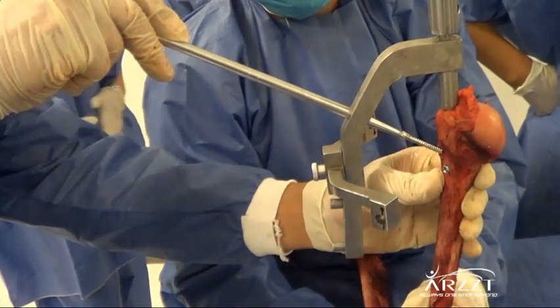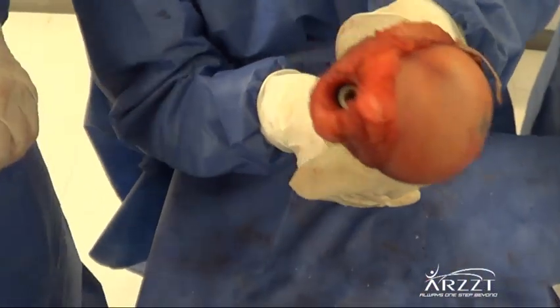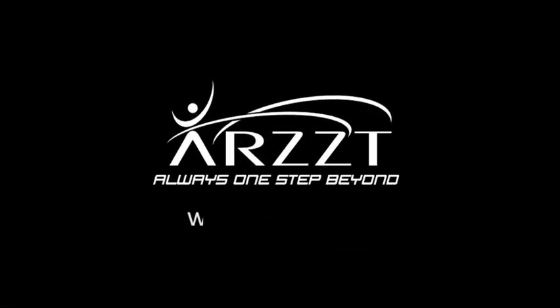The closure cap is inserted. The fascia is closed with Vicryl 2-0 and the skin with nylon 3-0, depending on the orthopedic surgeon's preferences. For more information on this and other techniques, please visit our website at arzzt.com.